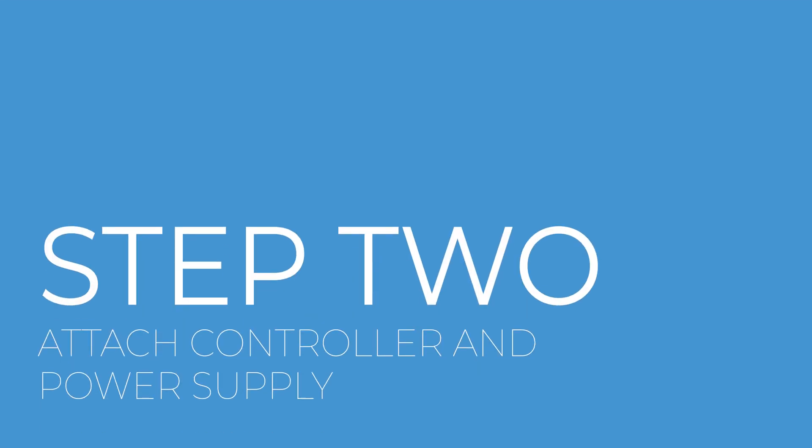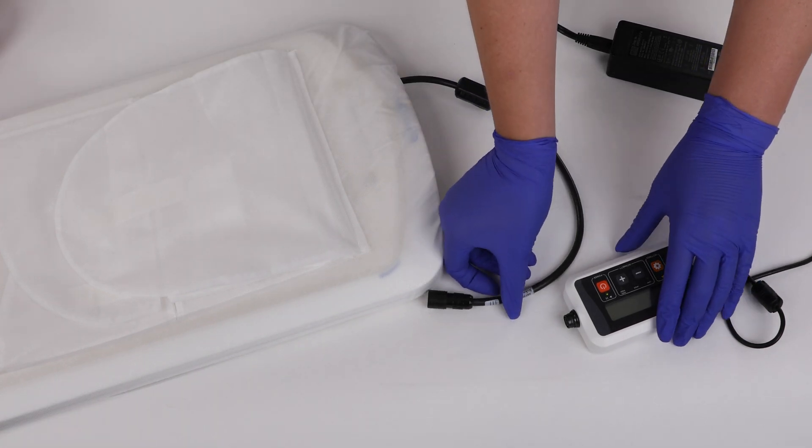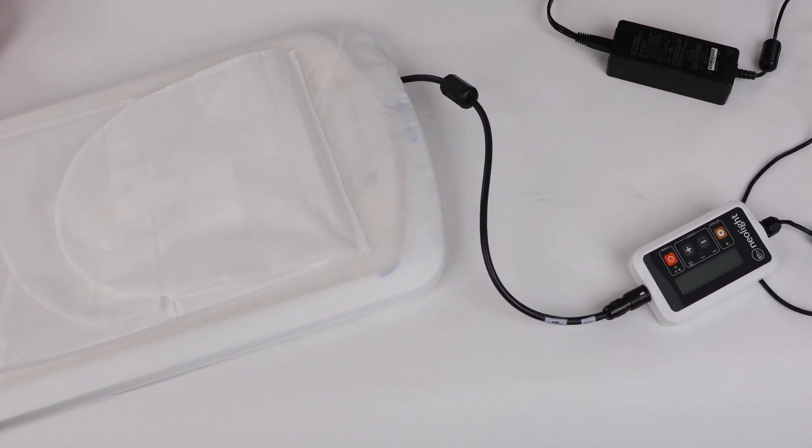Step 2: Attach the controller and power supply to the device and place the controller outside of your baby's crib or bassinet. Make sure the cord does not pose a hazard to the baby. Plug the power supply into the wall outlet.